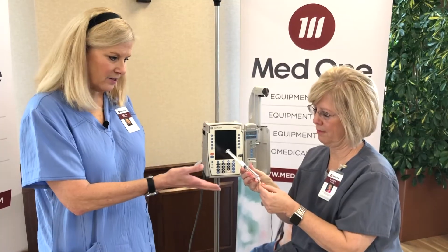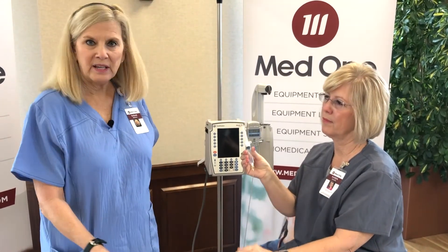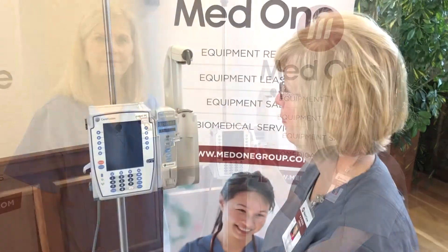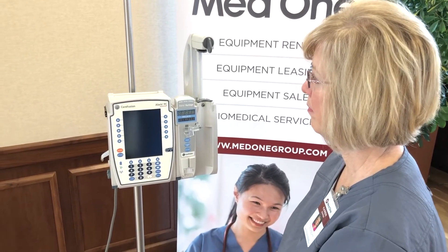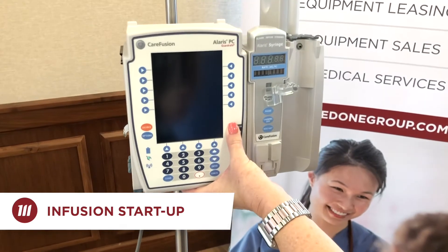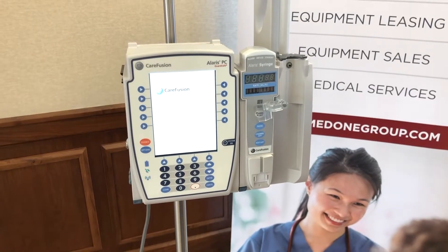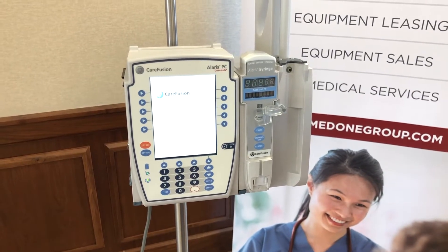Now we're going to move forward with an instructor-led demonstration. I'll be walking through scenarios and have a nurse do the actual programming, much like you would in your own hospital skills lab. We're going to have our nurse take a 10 ml syringe, attach an extension set, prime the syringe, and then simulate loading and starting an infusion. We'll start by powering on the device with the system on button and wait for it to go through diagnostics, confirming via the IUI connector that we have connectivity between the PCU and the syringe pump.